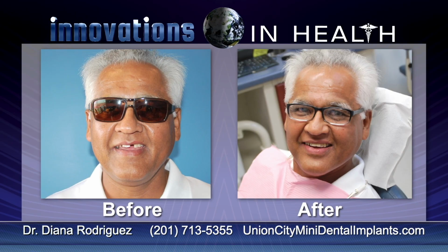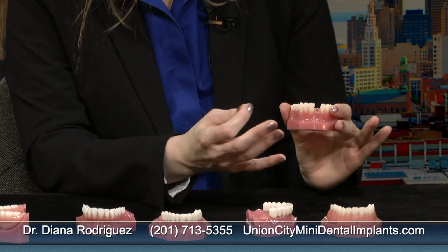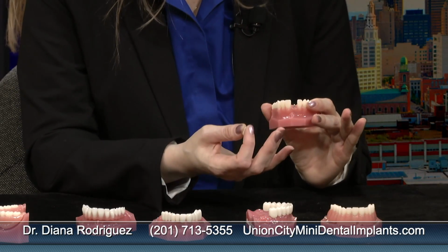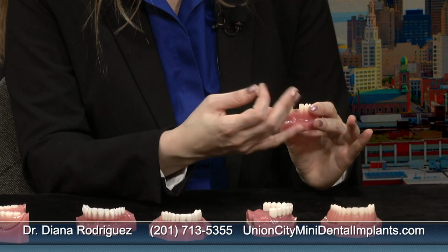In the case of a single tooth, the patient comes in, I discuss with them what their options are, whether it's the bridge or the mini implant and the crown. In most cases, I try to steer them in the direction of the mini implant and crown so that we don't have to touch those adjacent teeth. Because if the adjacent teeth are in excellent condition, I really do prefer not to touch them, because sometimes they develop a problem with those adjacent teeth in the future. They'll most likely lose the whole bridge. So if those adjacent teeth are in good condition, I just prefer not to touch them.